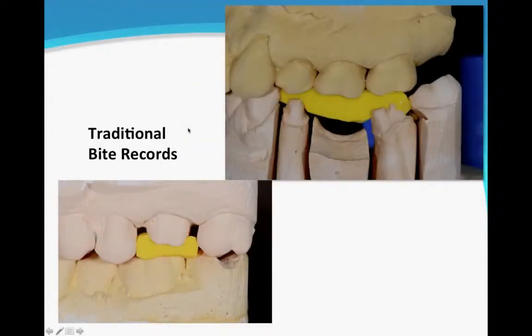What is it that dental laboratory technicians and dentists have done together since we invented addition reaction silicone for bites? We took those bites off of the preparations. The reason we did it is because it works. What I've always done is I mounted them right to it. You remove all of the tissue, and we're going to go through this a couple of times. You cannot take accurate impressions of tissue. That is for dentures and removable. So when you look at the matrix here, you can see that we cut it back so you can see how the preparation fits and how the tooth fits.